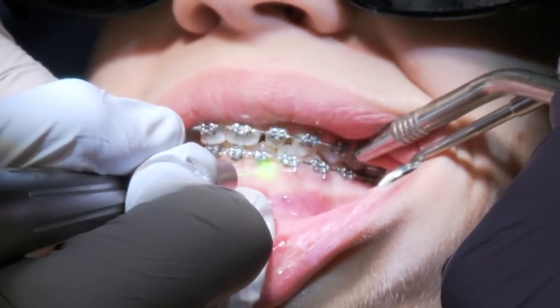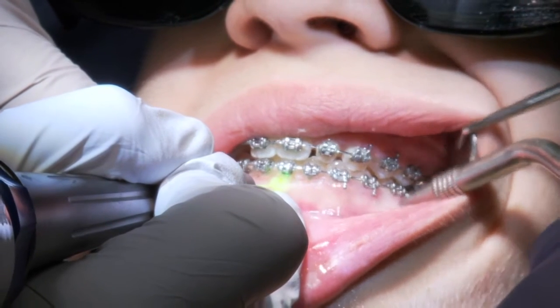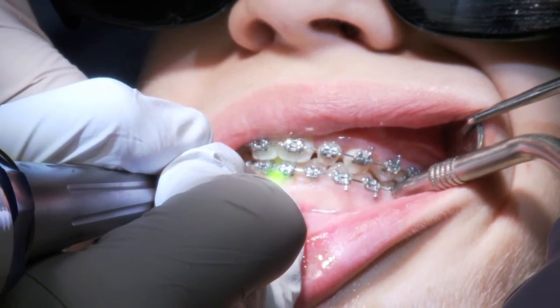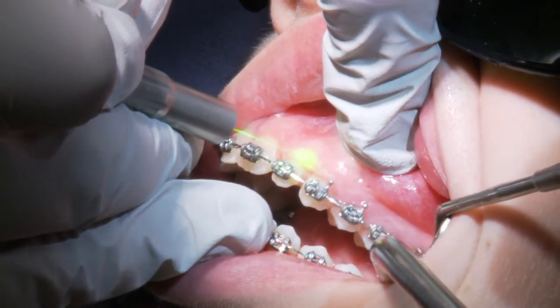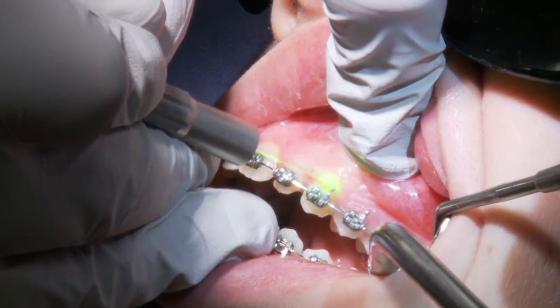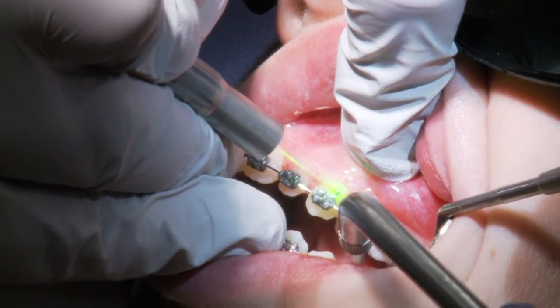We completed the entire procedure. We did need some anesthetic but used a total of less than one and a half carpules. Traditionally we would have used significantly more — probably at least five or six carpules, maybe more — and she was able to go through the whole thing.